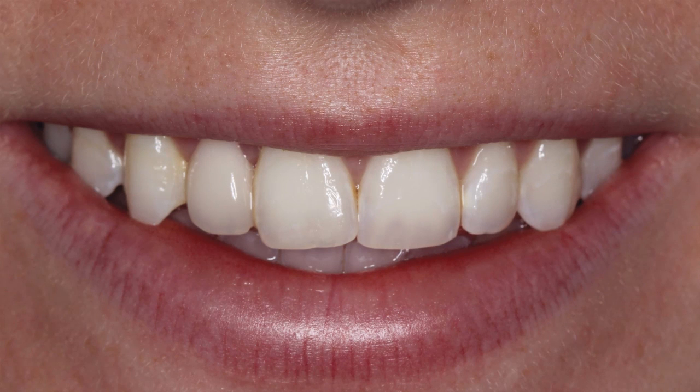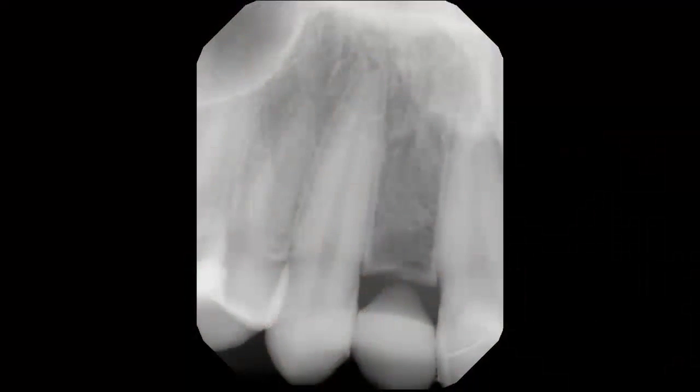As mentioned earlier, the lateral incisor site can present some difficulties when surgically placing dental implants. The facial palatal width is often compromised, especially for cases in which the edentulous condition is congenital. A digital periapical radiograph of the edentulous site indicated, however, that there was enough space to surgically position and accept the dental implant. Though there was limited space at the maxillary right lateral incisor site, radiography indicated that there was sufficient bone volume for the placement of an implant.